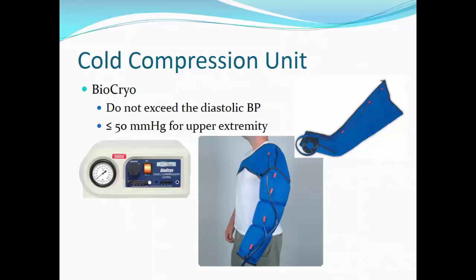Once the extremity compression units are properly cooled, they can be applied to the patient. This unit uses a gradient and is sequential in its device. There are 4 chambers on the leg or the arm which each compresses the body part sequentially.